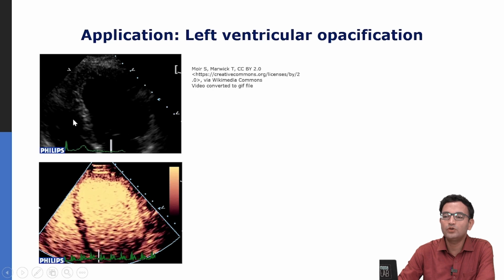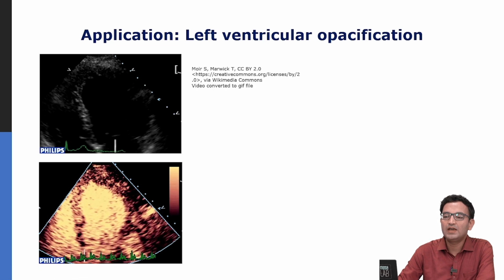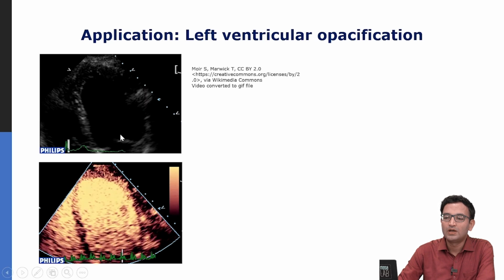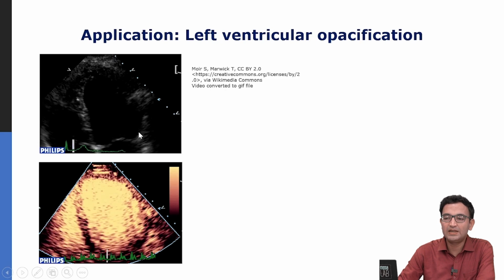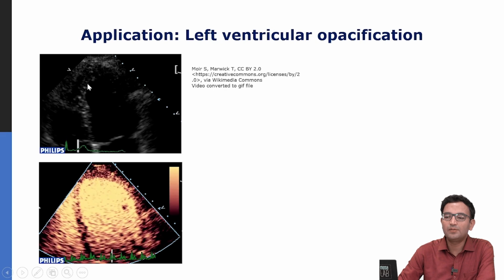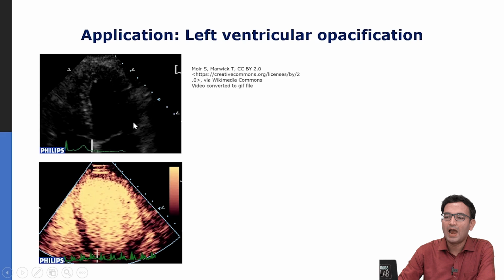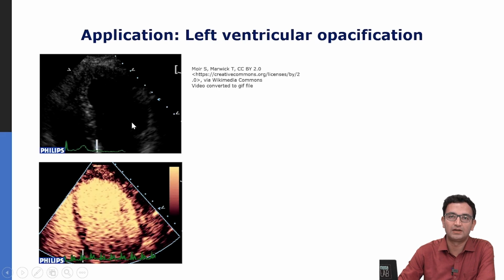So here I am showing you one application of contrast enhanced ultrasound. We are looking at this video of the heart chamber, and this heart is beating, the chamber is expanding and contracting, but because of poor signal here, it is a little bit difficult to discern the boundary of this heart chamber, and typically this is used to measure the volume of blood that is ejected.